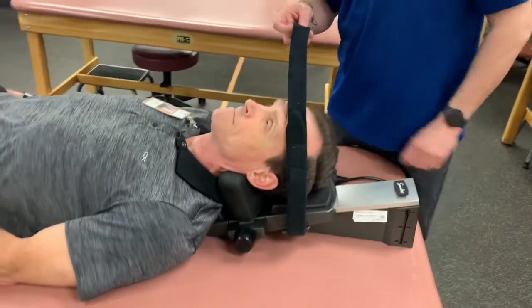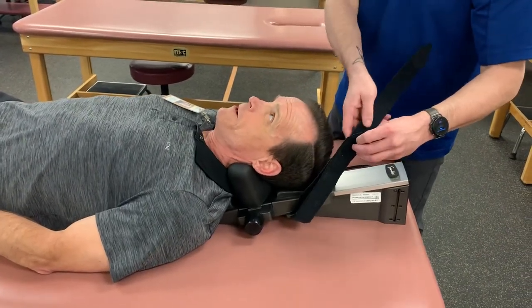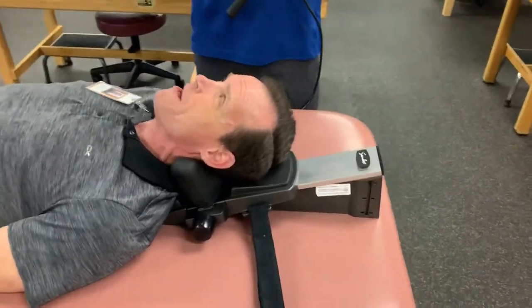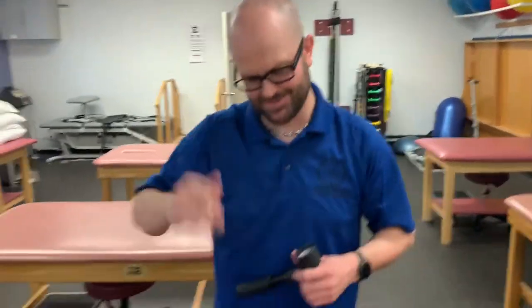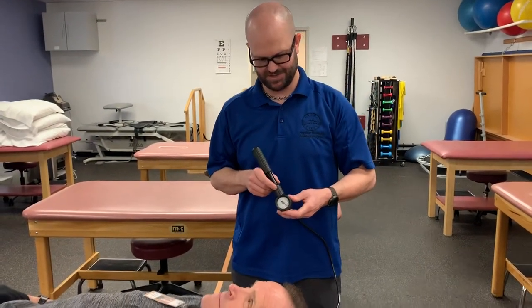Are you good without the strap or do you prefer the strap? You know it might mess up my hair. Okay, we'll leave it off then. Some people might get a little claustrophobic from it as well, so that's another reason you want to make sure that they're okay and comfortable with that.